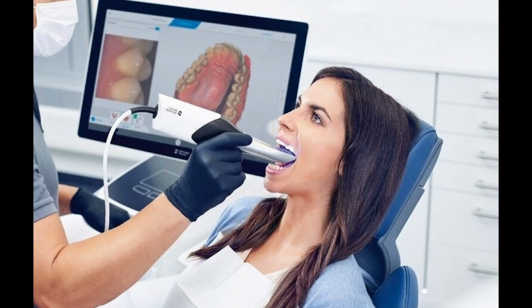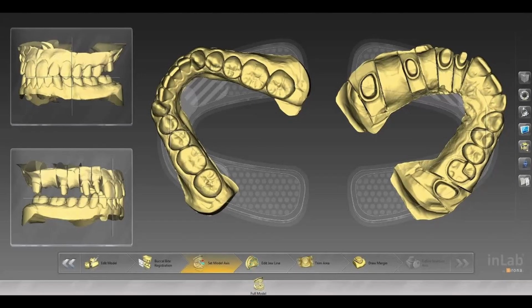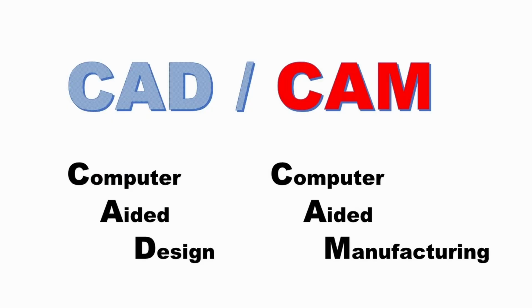The first comes when we scan a patient. Nowadays, intraoral scanners are able to help us to capture the patient's mouth in a 3D format. This is useful in terms of patient education because you are able to see what exactly we are looking at when we do our exam. It is also helpful for patients who have very bad gag reflexes, for example, because scanners allow us to capture the shape of a tooth, and this information can go to a lab to help us to manufacture a crown.